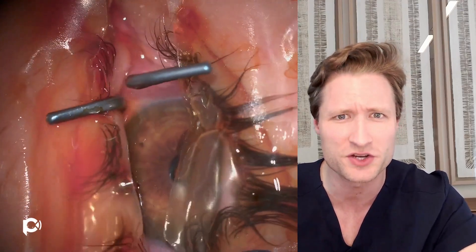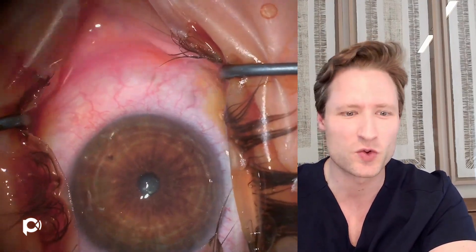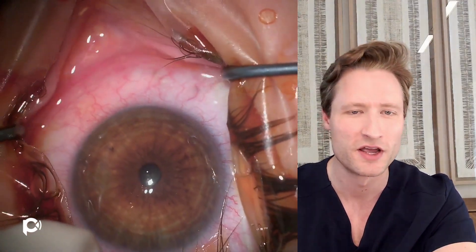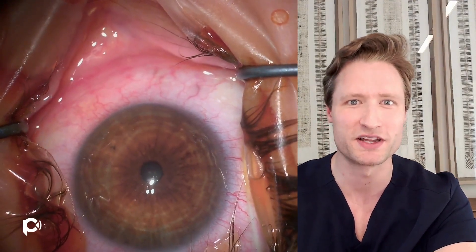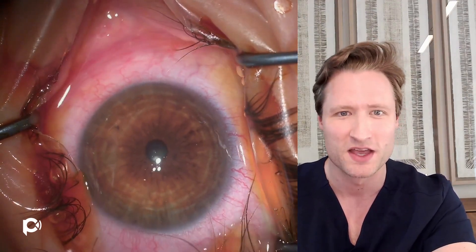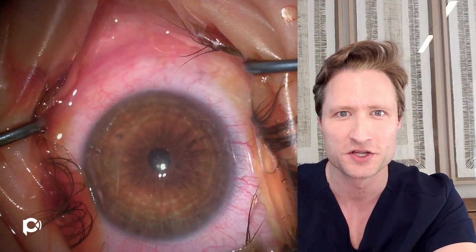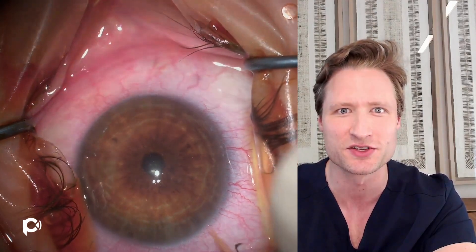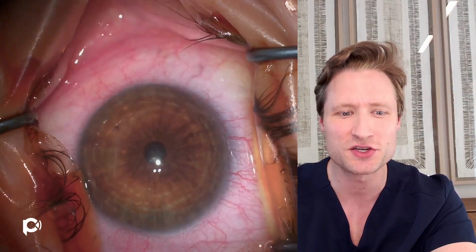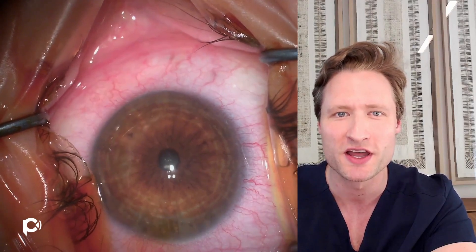This is an unedited video because I want to show you really all of the steps. The operation will begin by drying the corneal surface and then making an epithelial impression using a device called a zone marker — borrowed from the days of Intax implantation. This is a centration device that helps you plan where the incisions will be made. Because we're making an epithelial impression, we want a dry epithelial surface so that when you indent the epithelial cells, you can still see that impression.